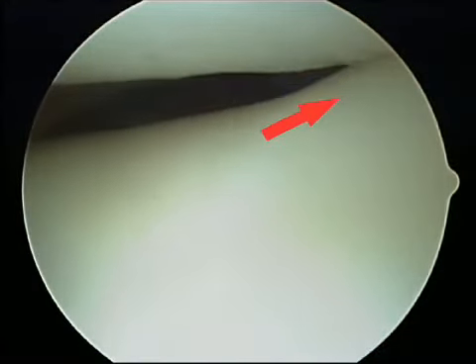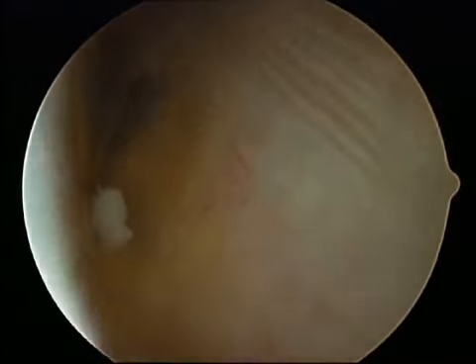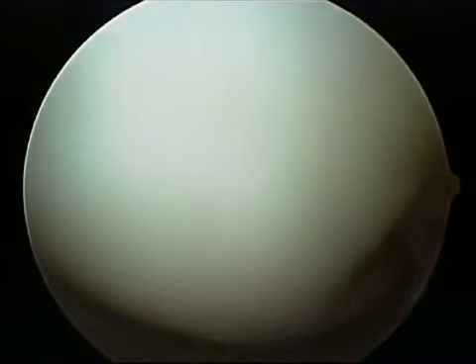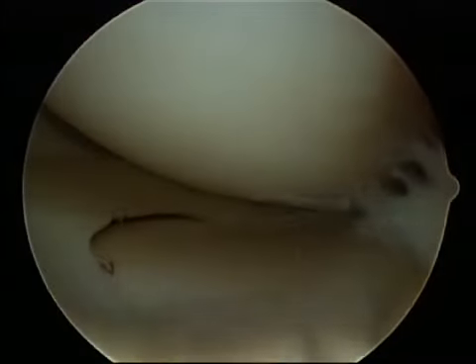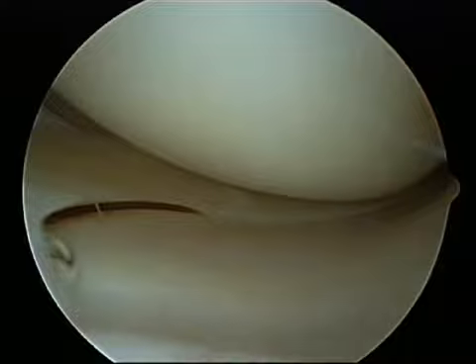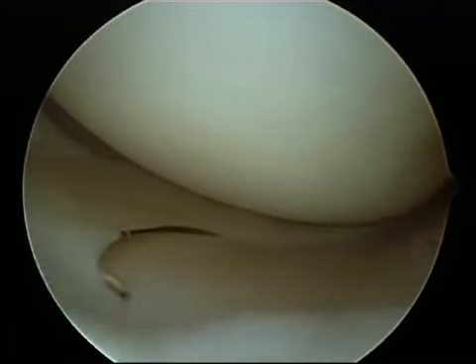Arthritis in this area can be very painful. The gutters of the knee are areas where loose bodies can be found. The white smooth surface at the end of the thigh bone is healthy, normal articular cartilage. This is the medial, or the inside of the knee. If there is damage to this surface, a debridement, or cleaning, can be performed to stabilize loose flaps.